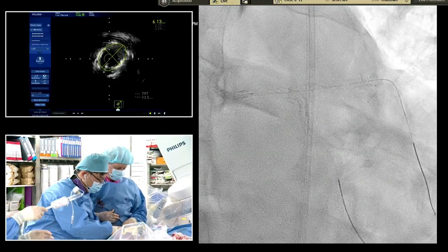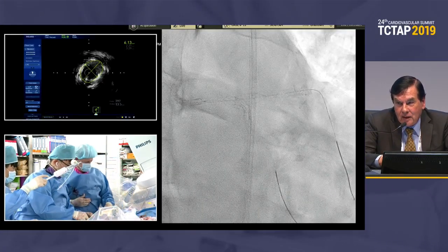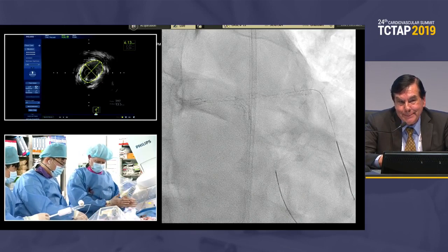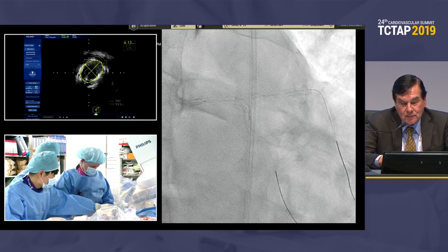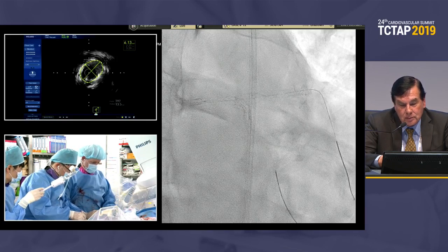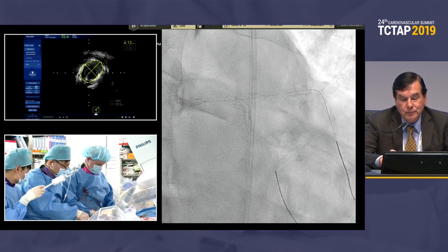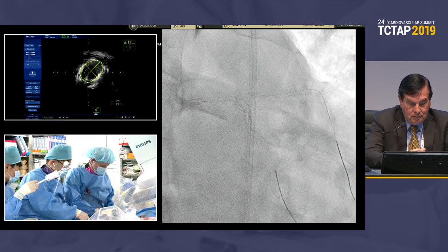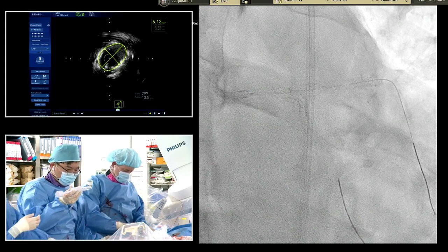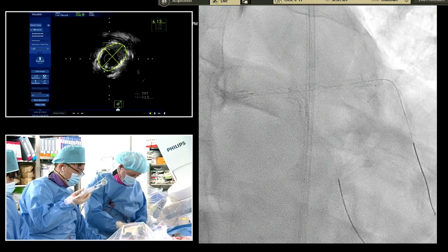James, what do you think about the mechanism of this restenosis? Too many stents. Yeah. First, too many stents, but is this neo-intimal hyperplasia or neo-atherosclerosis? I think it was neo-intimal hyperplasia, but in a maybe undersized, under-expanded stent. Too small size. And would you think about a DCB? Well, we plan to do a DCB, but we want to make sure we've adequately prepped it before doing that. Okay. But this is probably the last chance we're going to have to correct this problem. He's got 3 stents there, kind of in the distal LAD, proximal circumflex, and LAD. Distal main, excuse me. So it's getting a little crowded.